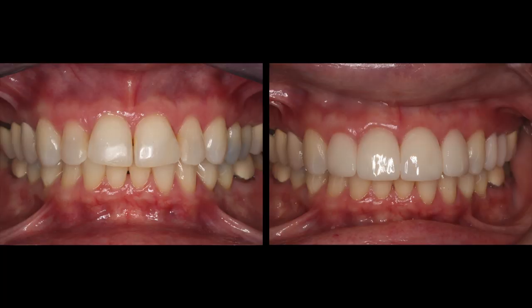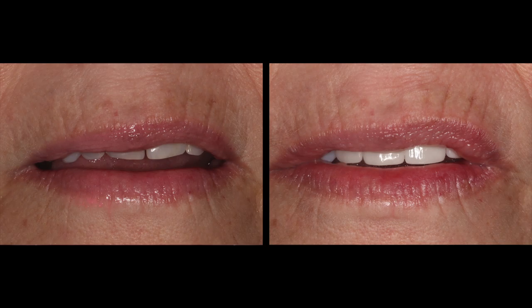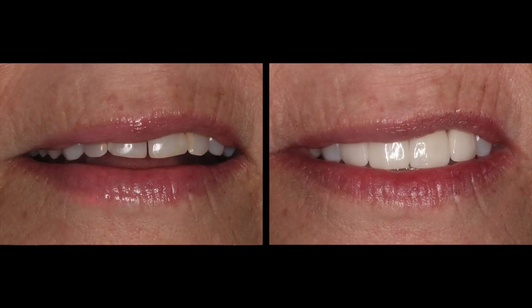So this is before and after. We've got four veneers on the maxillary anterior teeth, and these are Emax veneers. For years I did porcelain veneers. I still like porcelain veneers. Just Emax are a little stronger and they're very beautiful. Lithium disilicate. So before and after.